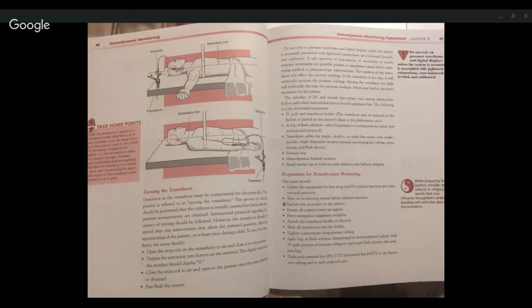Replace any vented caps on stopcocks with non-vented dead end caps. Recap the distal end of the pressure tubing until ready to connect to the catheter and patient. Ensure the transducer cable is connected to the monitor. Set the scales on the monitor to the 0 to 40 range to reflect pressures accurately. Follow the procedure for leveling and zeroing the system.